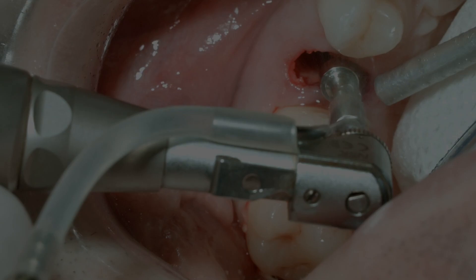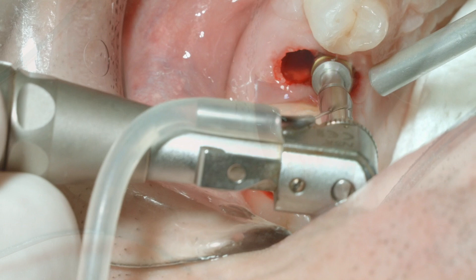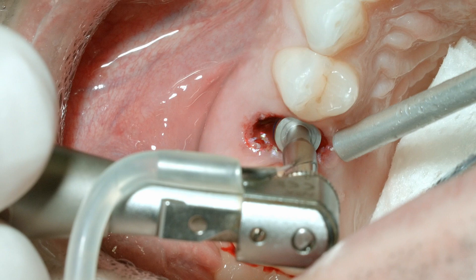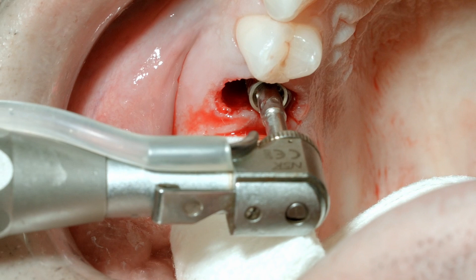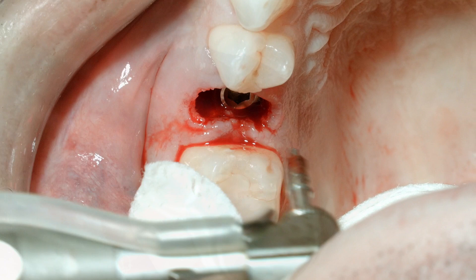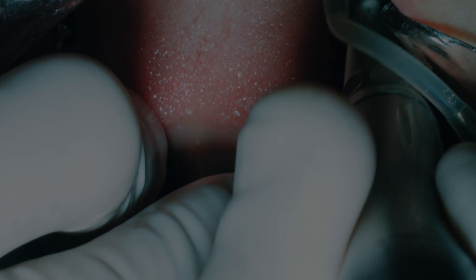Our next site is an immediate placement of a second bicuspid. Here again we're seeing the preparation with the multi-drill technology, going down towards the palatal wall of the socket. Here the final preparation with the number four multi-drill — this will be a four by 15 millimeter fixture being placed. This implant has adequate primary stability, though slightly more limited because of the limited bone available with the large long root of the bicuspid. This socket will be grafted with base bone freeze-dry bone allograft once the implant has been placed. Here we can see the post-operative radiograph after the bone graft material has been placed into the surrounding socket.